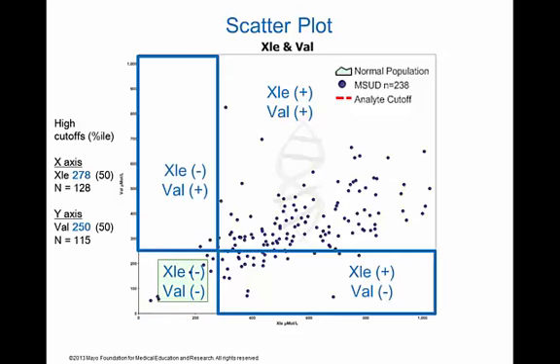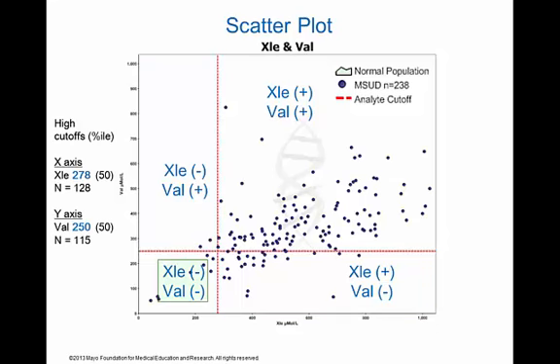The other two quadrants show what we may call the mixed results, one positive and one negative. Clearly, many cases with MSUD had available results below the median cutoff value, information that could help in the interpretation of challenging cases. What happens when different cutoff values are selected?